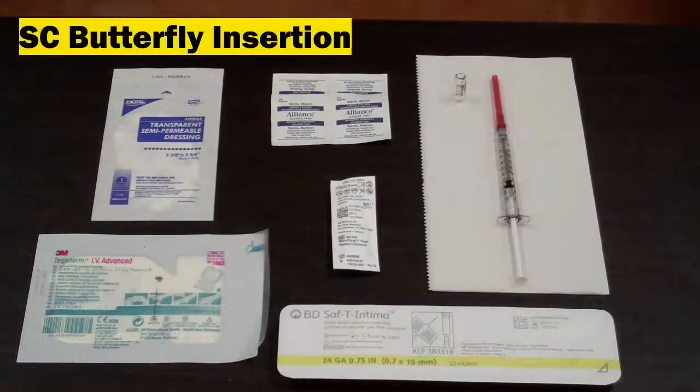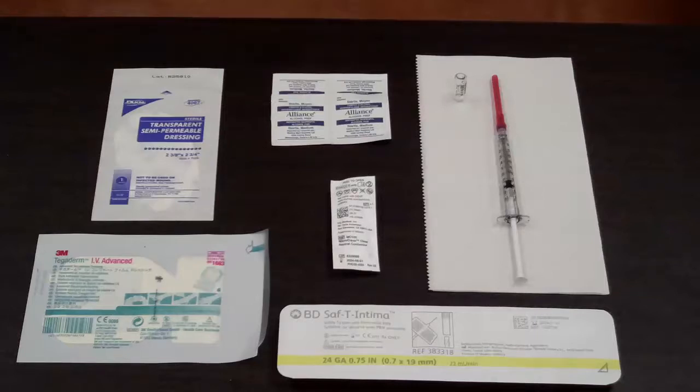First, gather your supplies and ensure you have a clean surface to put them on. You will need a transparent semi-permeable dressing such as Tegaderm, several alcohol wipes, a microclave clear connector, the Safety T Intima subcutaneous butterfly, and your prepared injection plus 0.21 mils for priming the subcutaneous butterfly line.